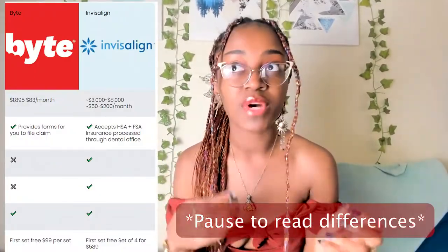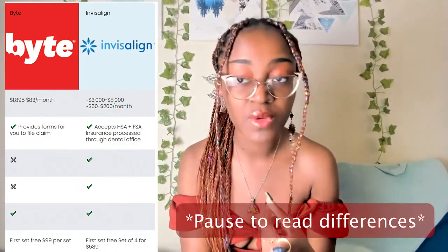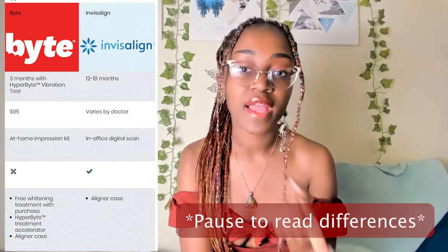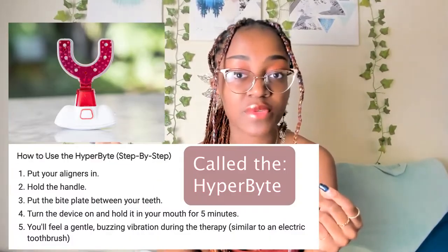But this is a legit company brand that specializes in 3D printing aligners, similar to Invisalign, but in comparison to Invisalign it is a lot cheaper and a lot faster because it has a certain device that I use every single night that speeds up the process by about twice as much. So let's get into this video.